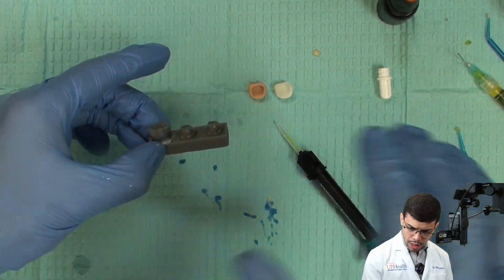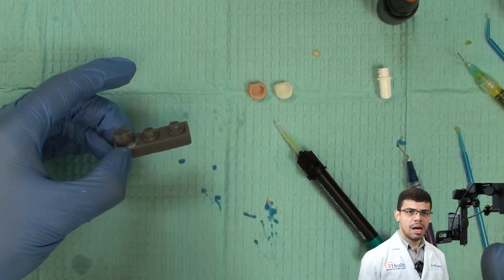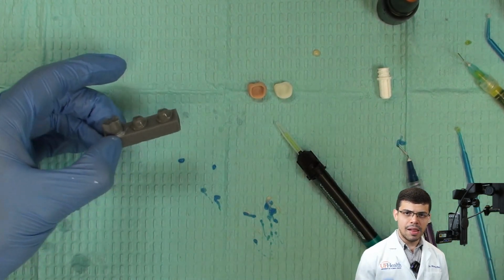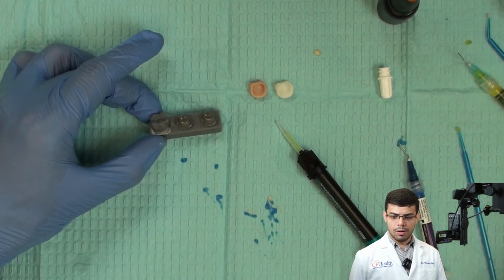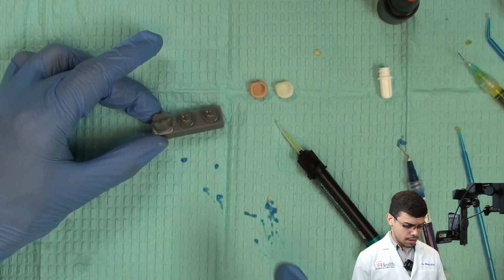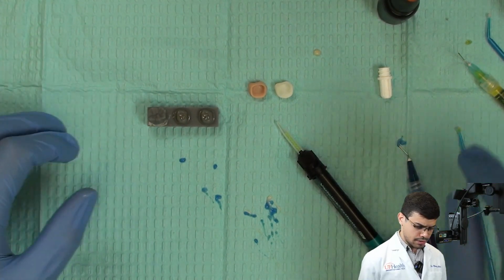Here in the school, we light cure everything together because we don't want to have the risk of having a pool of cement and then the crown not sitting properly. Okay, so let me air thin this. All right, now that we have the adhesive here, it's time to do the cement, all right?